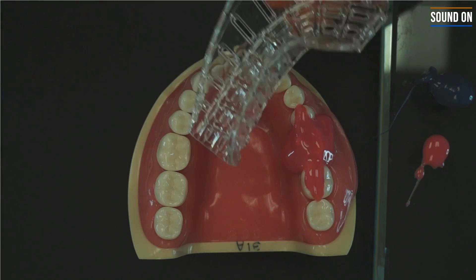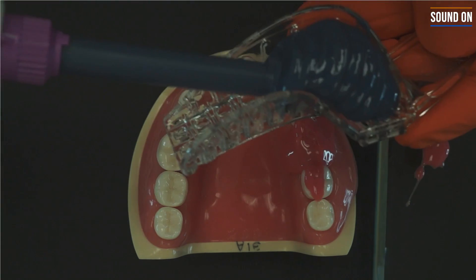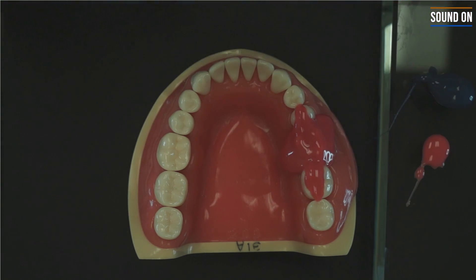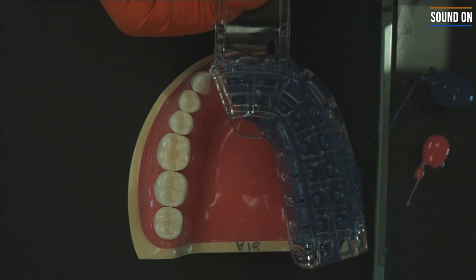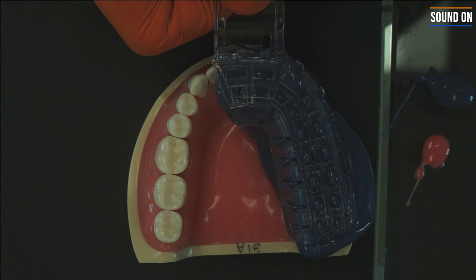Now, place the material on the tray. Dispense the first part, then use the tray material on the tray. In this case, we're using the hand mix, but we can use the panda mix as well. Then complete the impression.